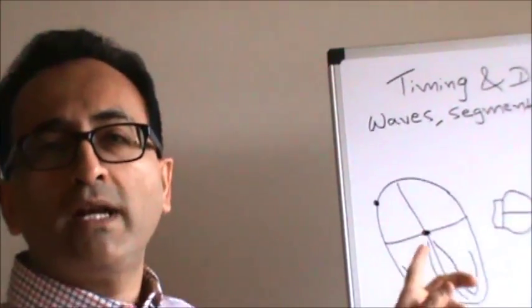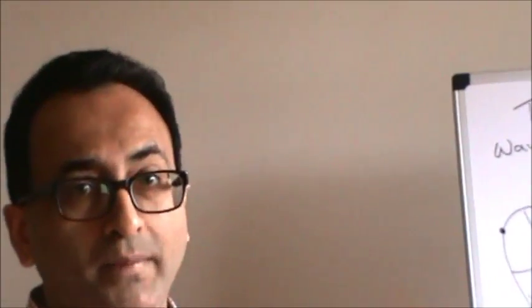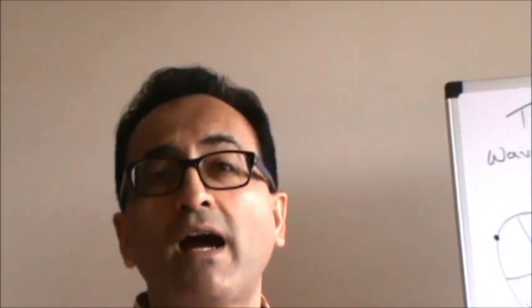Now if you add 2.5 for P, 2.5 for the PR segment, 2.5 for the QRS complex, how far are we so far? That comes to 7.5, right? If you add another 2.5, it comes to 10 small squares. Okay, you remember the QT interval that I was talking about? On average in a healthy, normal heart, the QT interval takes 10 small squares.